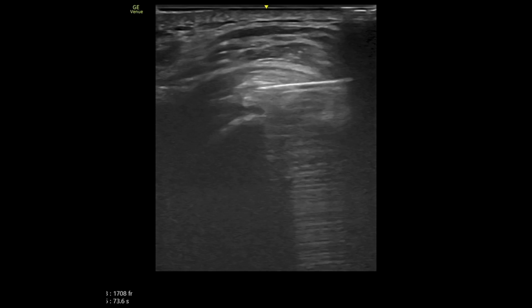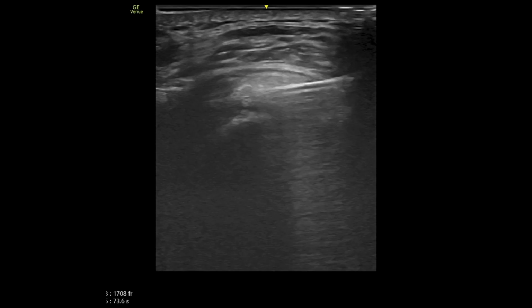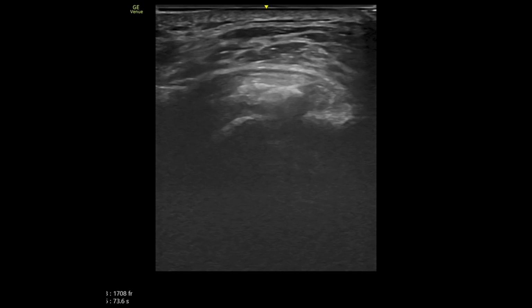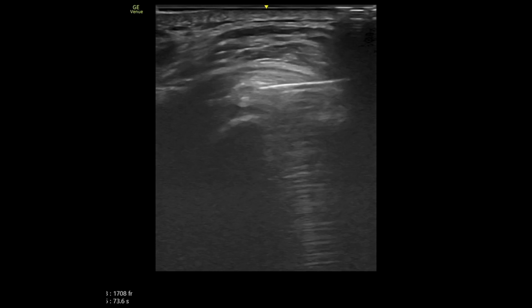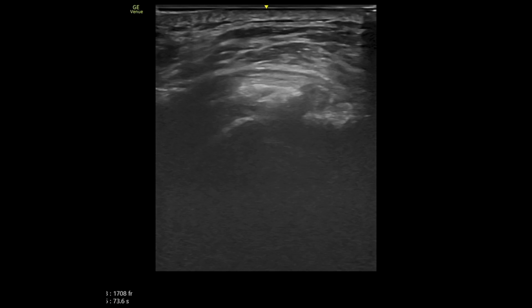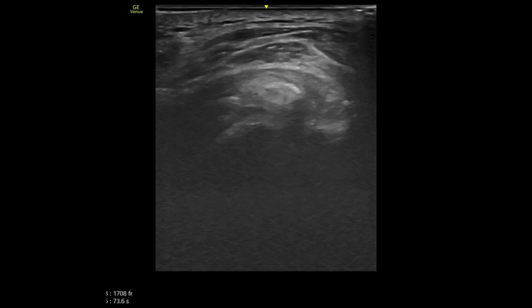Decompressing the calcium can be time-consuming, even for the experts. Excessive pressure at the barbotage's onset can rupture the calcium wall, leading to fluid leakage. Consequently, the cavity won't maintain the internal pressure, making mixing the injected fluid with the calcium deposits challenging. Exercise caution and avoid applying sudden, strong pressure. It's akin to having sand in a crystal ball.